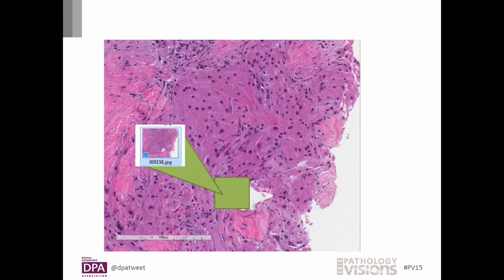The images we used were not actually traditional photomicrographs, but static images taken from Moffitt Cancer Center's whole slide image database. We have a virtual remote desktop suite that allowed me to access the whole slide image repository remotely and take still images from there. The whole process took only a few hours.